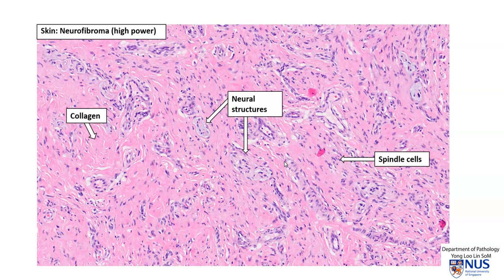This spindle cell proliferation does not show any features of malignancy. In summary, neurofibroma is a benign peripheral nerve sheath tumor that is composed of Schwann cells, fibroblasts, and in-between collagen fibrils. Thank you.